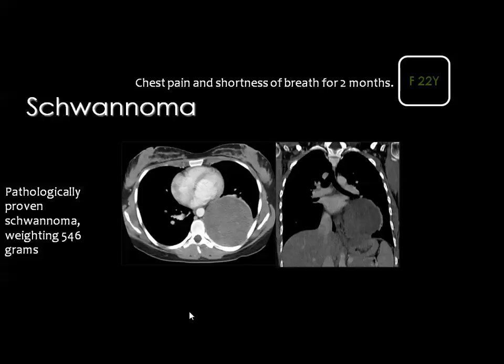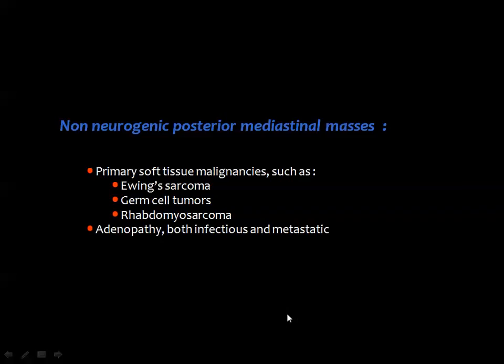And you should remember that schwannomas have the tendency to be cystic or look like cystic lesions. They also have lower density and lower enhancement compared to the neurofibromas. Non-neurogenic tumors in the posterior mediastinum are not diagnosed from imaging.